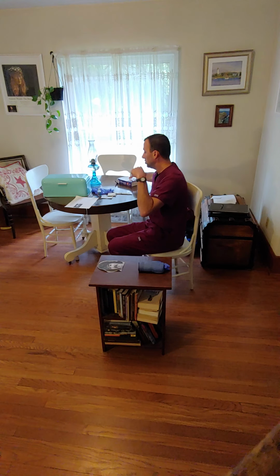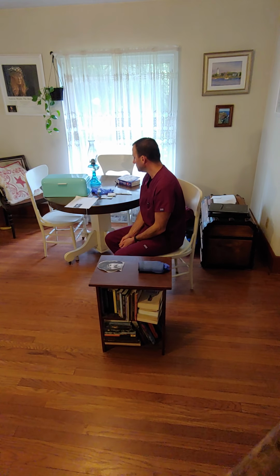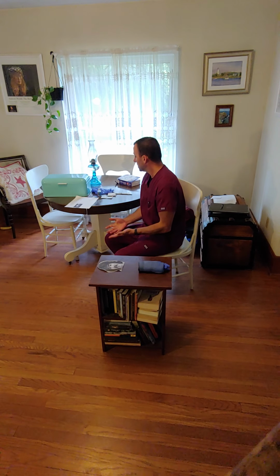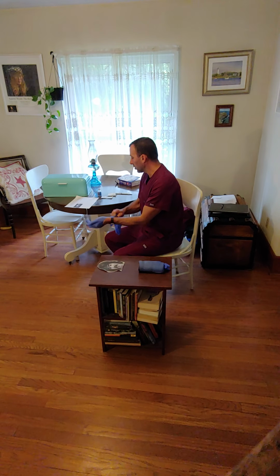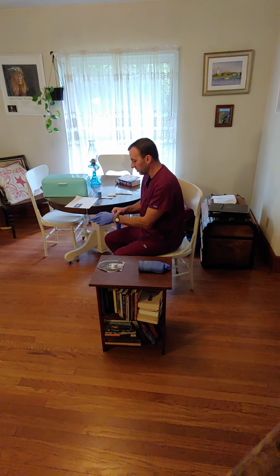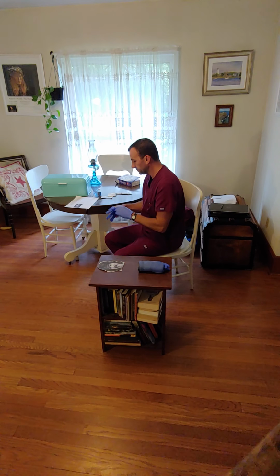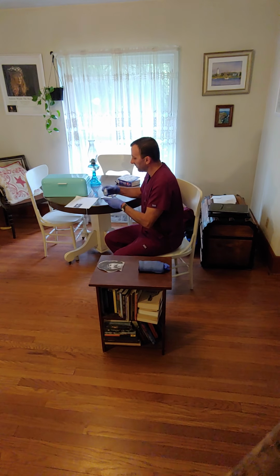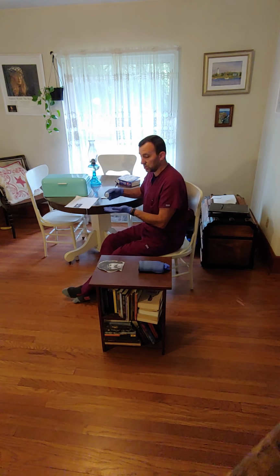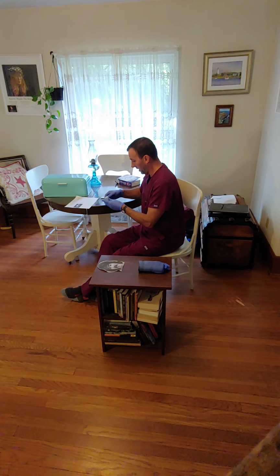We're going to move on down to the Pyxis and go in and do our first and second checks and prepare the medication. So as I come into the room, I'm going to do hand hygiene and get my PPE on. We're going to do our first check as we withdraw the medication from the Pyxis. So what we've gotten out is morphine sulfate injectable, 5 milligrams per milliliter. That's what we need. It matches up. We would scan that if we needed to follow the policies of the facility. And so we'll say that we have done that.